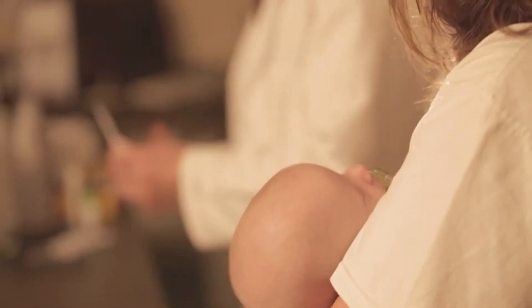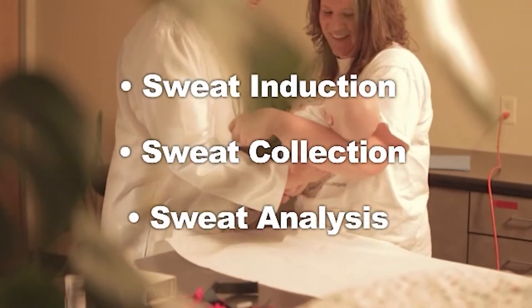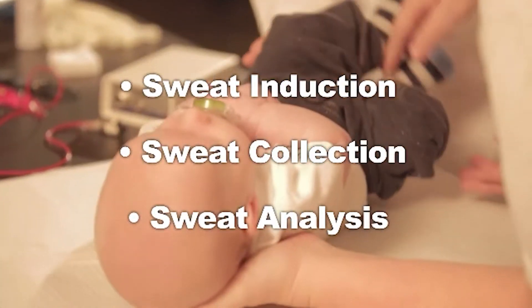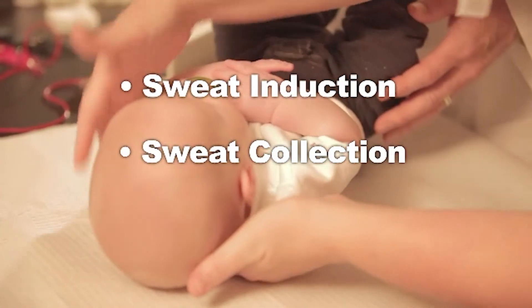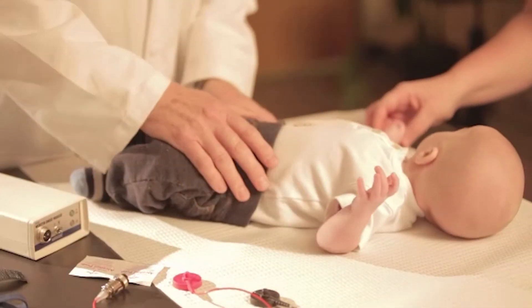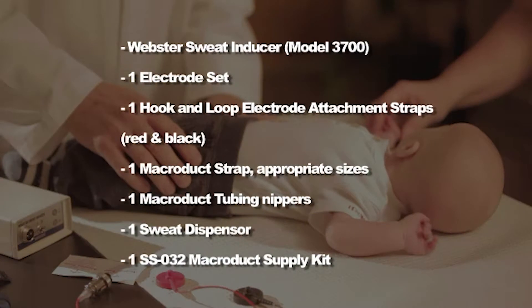The sweat test is a composite of three separate sequential procedures: sweat induction, sweat collection, and sweat analysis. In this video we'll be covering the first two sections — sweat induction and sweat collection. The following are the supplies that will be needed to perform sweat collection.